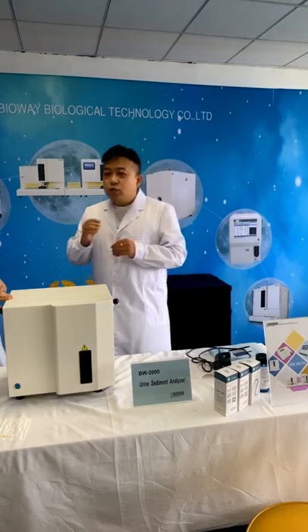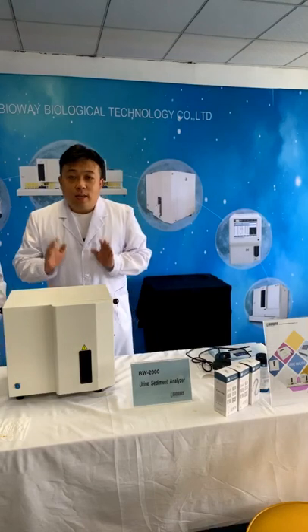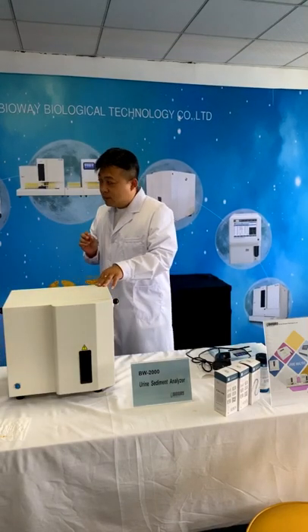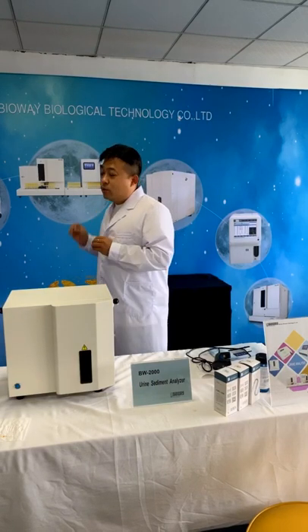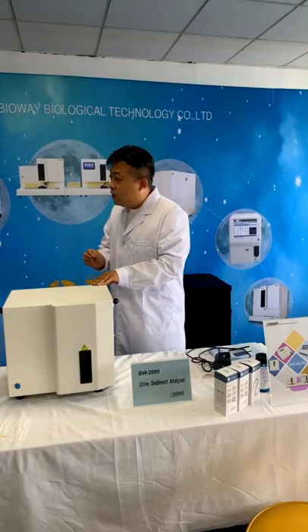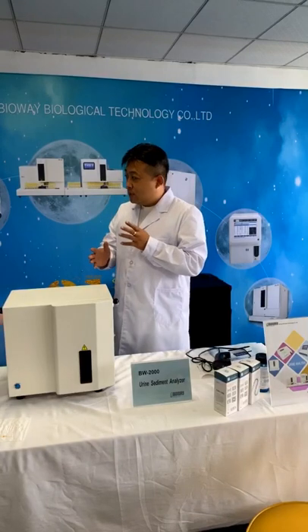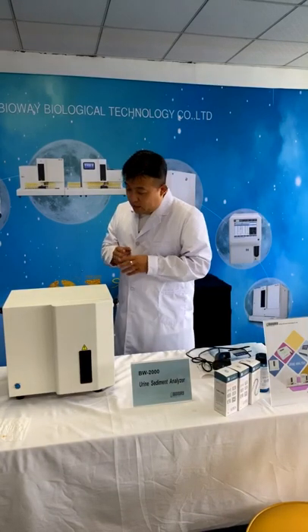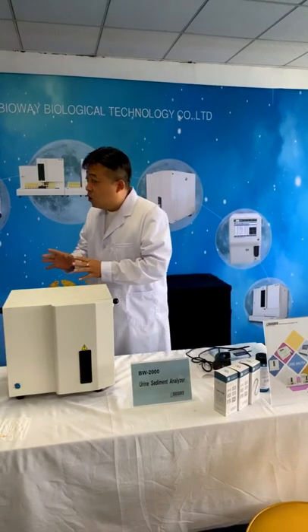In short, a urine analyzer is just for the chemistry part. The full name is urine chemistry analyzer. But the urine cell analyzer is just for the physical part. So these are two directions, two subjects. One is for chemical and one is for physical.